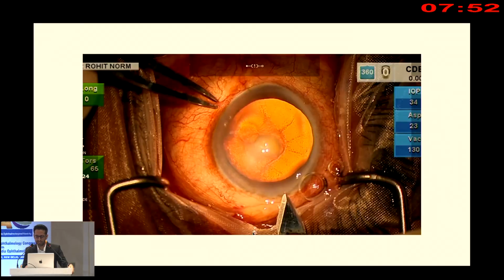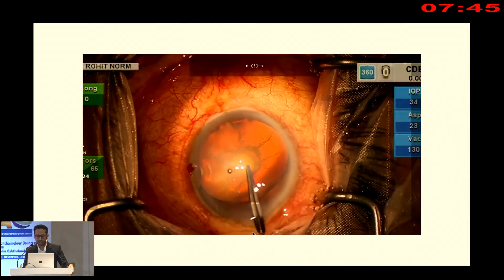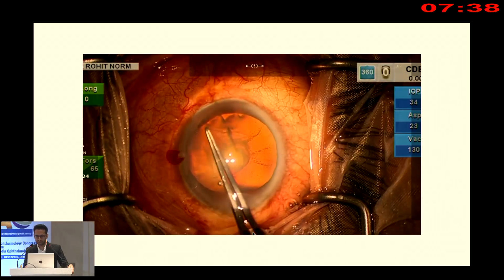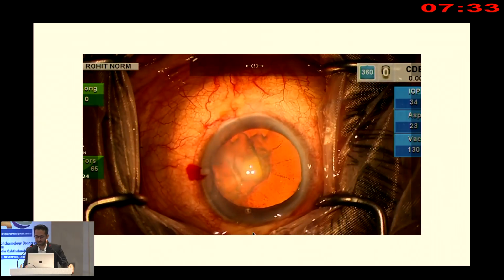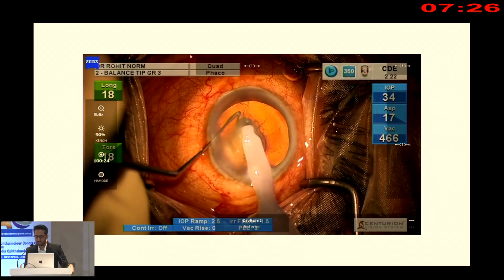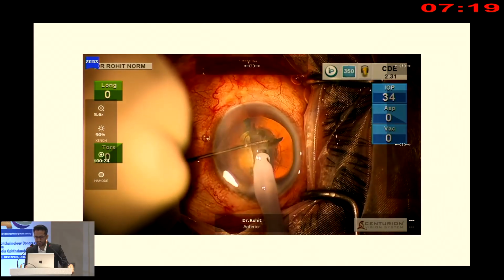Starting with the case, the first important thing is to have calibrated incisions, to have minimal leakage and good chamber stability, and an oval rhexis, as I already told you about the advantages, it gives you both a small and large arm of rhexis, and an option of doing an optic capture later on. My aim here is to do a stop and chop technique, slow sculpting, slow division of the nucleus, and slow motion phacoemulsification, because you can see here I'm slowly dividing the nucleus hemispheres.